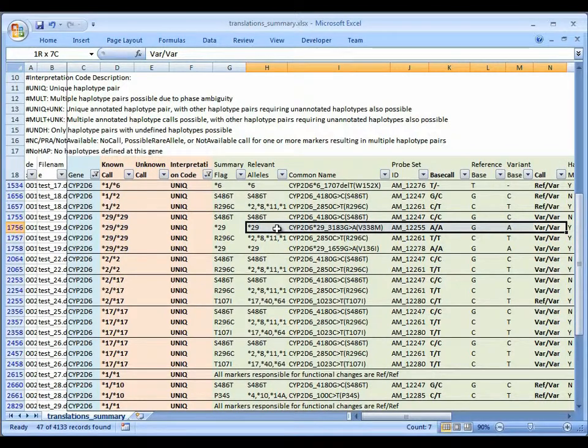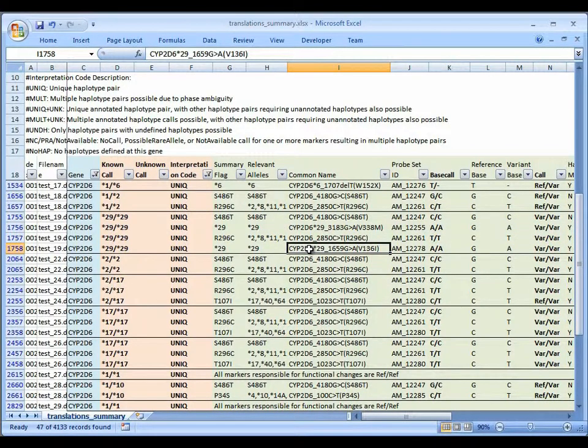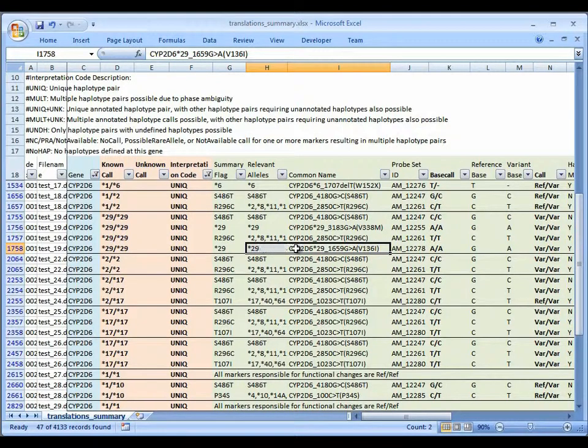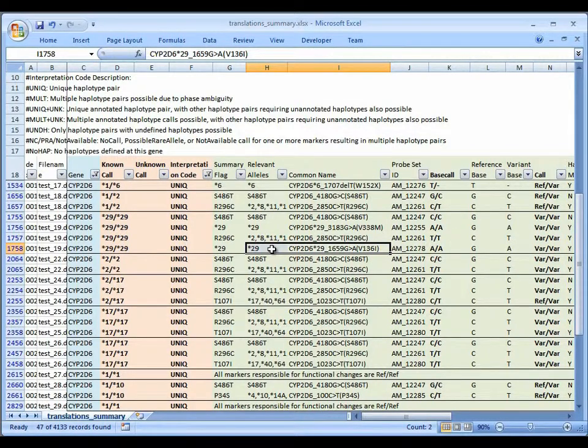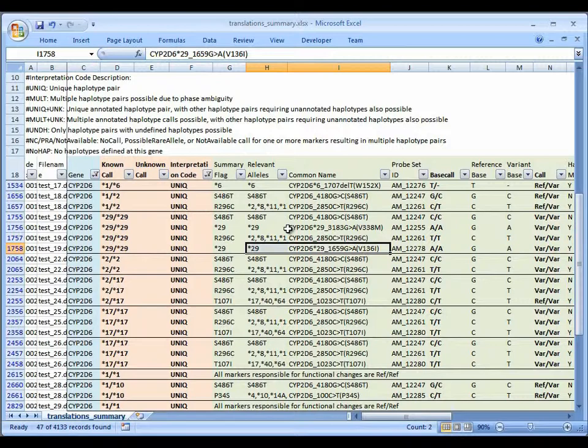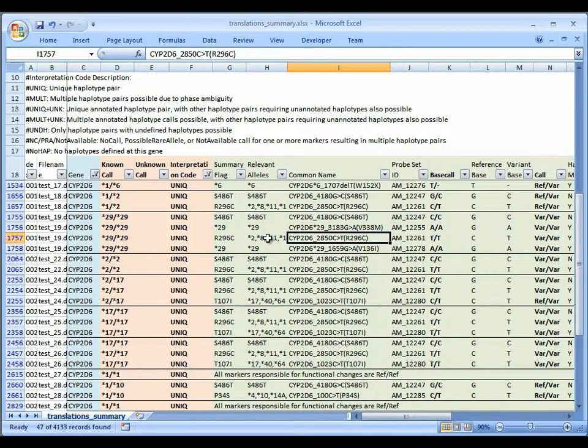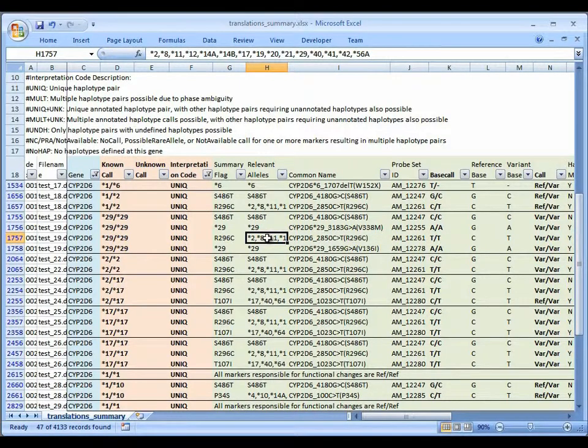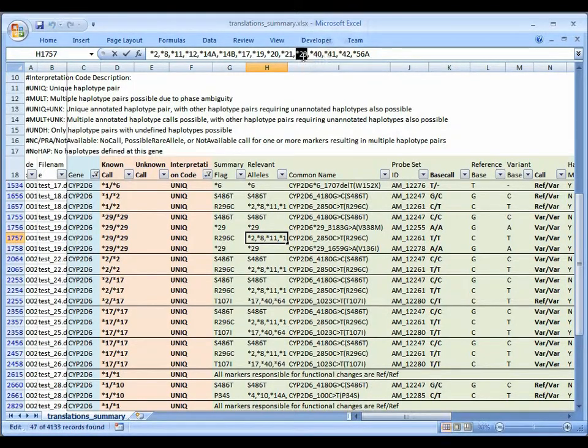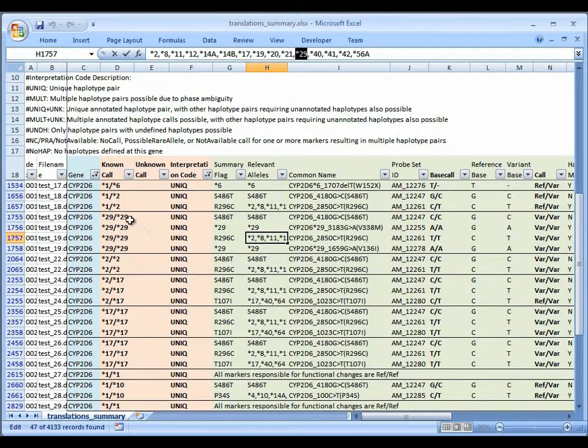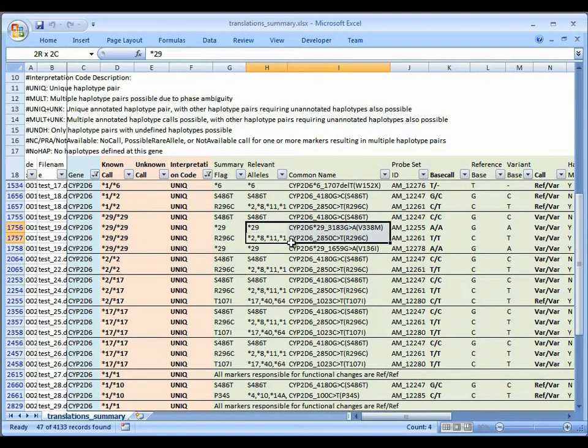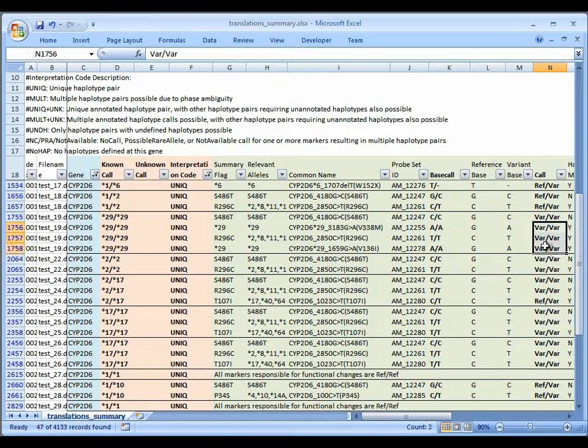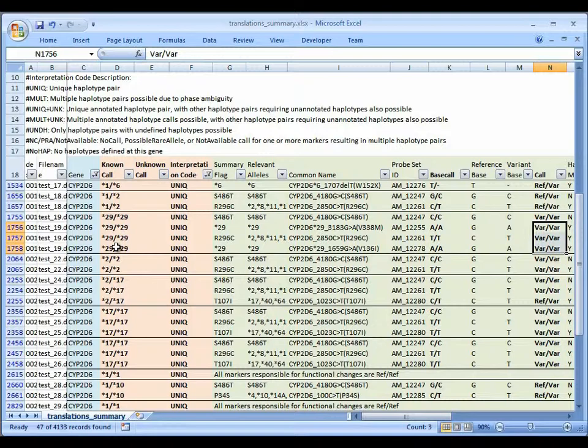Let's see if the other markers agree with that identification. This fourth marker also used for haplotyping. According to the relevant alleles column, only in the star 29 allele does this marker appear variant. And it is homozygous variant. So, this marker backs up the second marker for calling star 29. What about this third marker here? It turns out there's a lot of alleles for which this marker is variant. All of these star alleles list this marker as a variant. One of them is star 29. So, if you did have two star 29 alleles, this pattern of genotypes is consistent with the star 29, star 29 call. So, that's the unique code.